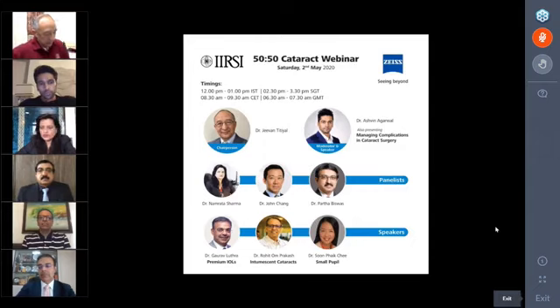Regular patients we don't do. Only when we see in the IOL Master that there's some degree of astigmatism, and sometimes you need to correlate to get the correct axis or the correct amount of astigmatism. Only in those cases we do topography, not for all cases.